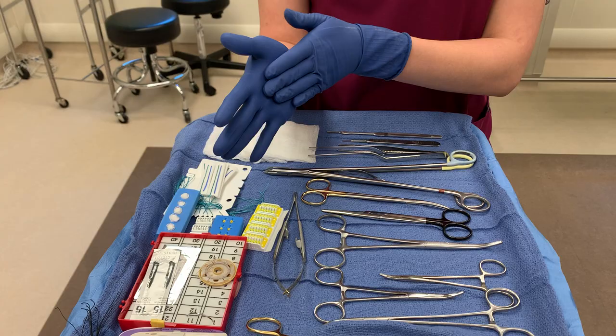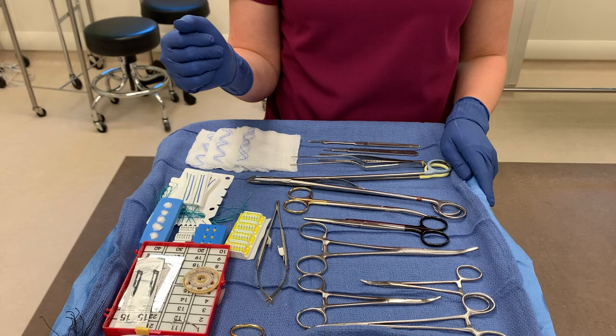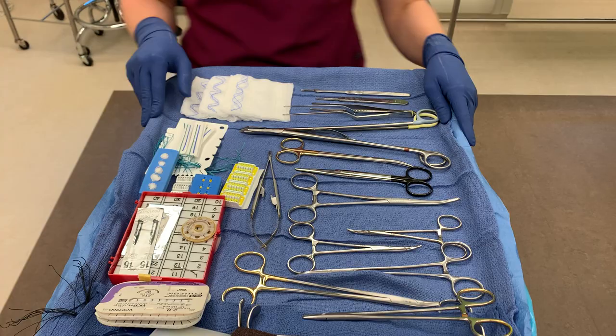For ringed instruments, they'll usually just put their palm out like this so that you can place the ring in their palm. And that is all for the hand signals for instrumentation.